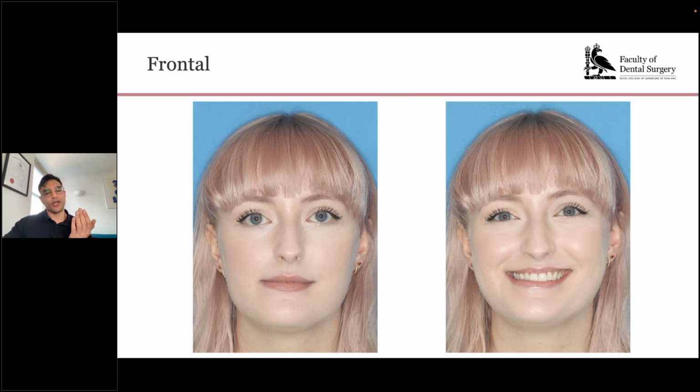You say, I want you to look nice and relaxed into the lens of the camera, and you take the first photograph. And then you don't move the camera away from your face, because if you've set things up properly and you know that the settings have worked effectively, then you should be able to move directly onto the second photograph. And that means everything else remains the same except for the smile.